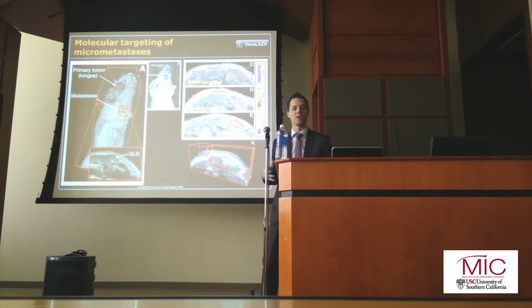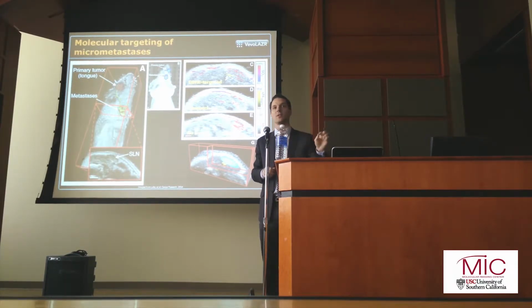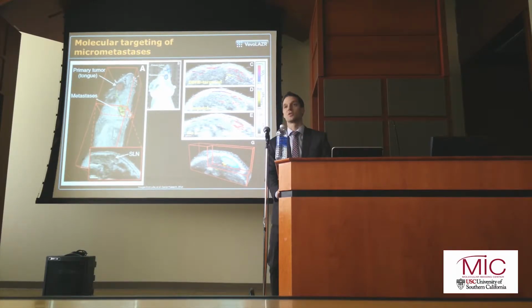So this is a really nice example, and again, that puts together a lot of the different capabilities, from just doing anatomy and finding these different structures to then being able to say, yes, there are metastases in this structure based on the targeted particles they were using.